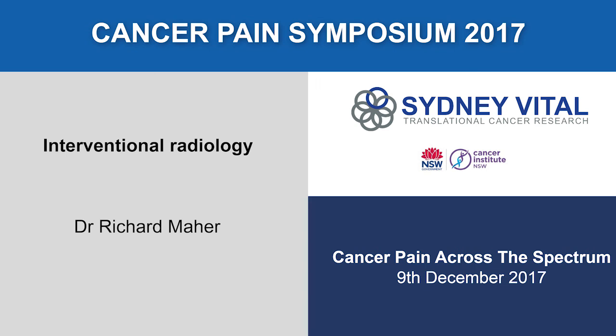But I just think that the pancreas and the retroperitoneum is not a good place for ultrasound just because it's hard to see. So technically I have never had much luck in trying to do it. Occasionally we get asked to do pancreatic biopsies and they're always tricky, but we do try with ultrasound guidance. So I think it's more a visualisation issue. If you have a very skinny patient, a cachectic patient, they may definitely be suitable.